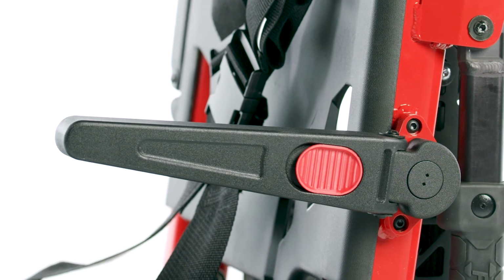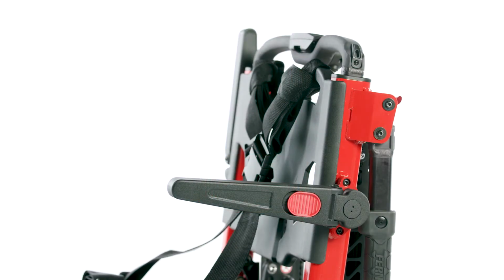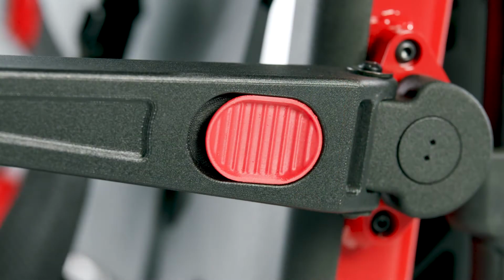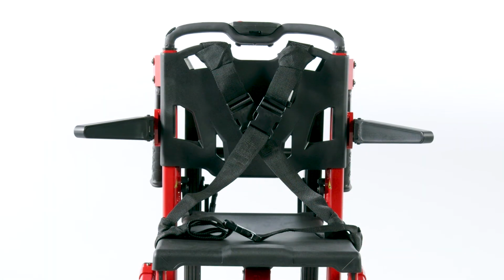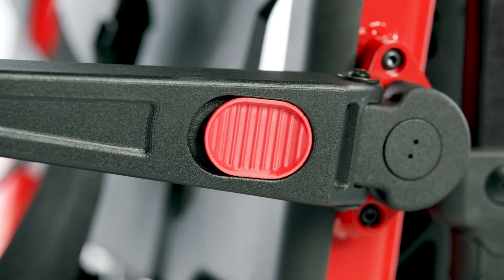The optional armrests have 3 positions: down, up, and out. To move the armrest up or down, rotate the armrest to the desired position. To widen the armrest, slide the red release lever forward and swing the armrest out. The armrest can be returned to the standard down position by pushing inward.